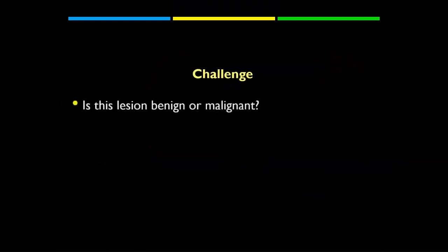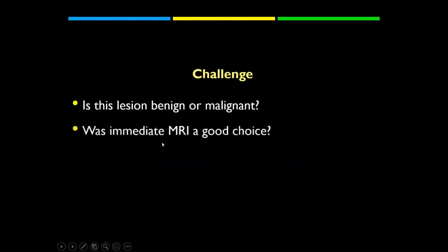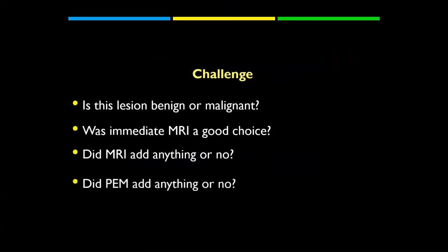So the challenge in this case is: is it benign again or malignant? And was immediate MRI a good choice or not? Did MRI add anything or not? And did PEM add anything or not?